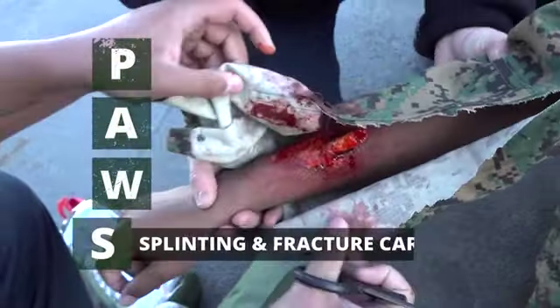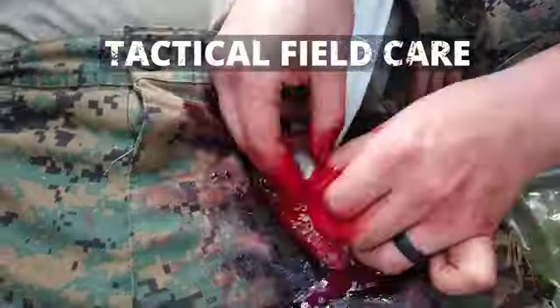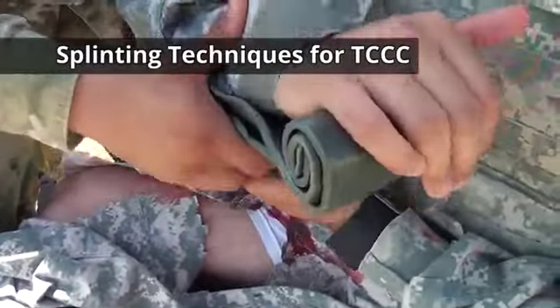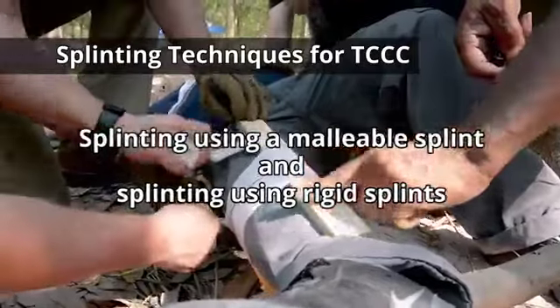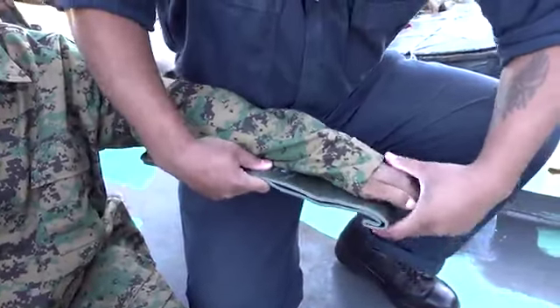Splinting and fracture care are the S in the march-pause sequence and take place in tactical field care once all other life-threatening injuries have been addressed. The basic splinting techniques for tactical combat casualty care, or TC3, are splinting using a malleable splint and splinting using rigid splints. The difference between malleable and rigid splint application is minimal.